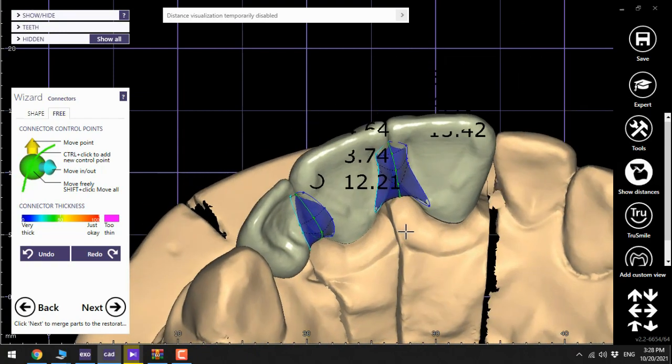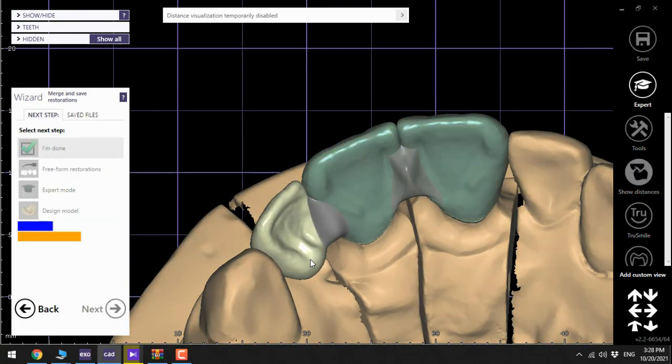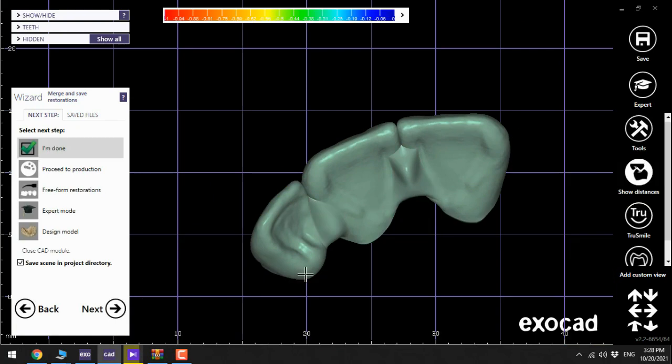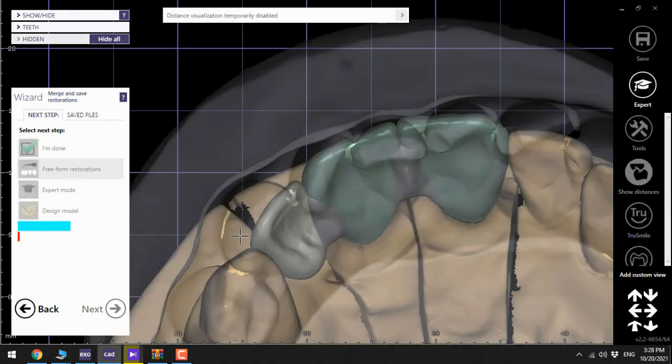Try not to modify it in this step, I will do it later. Click next and then go to freeform restorations, click next.